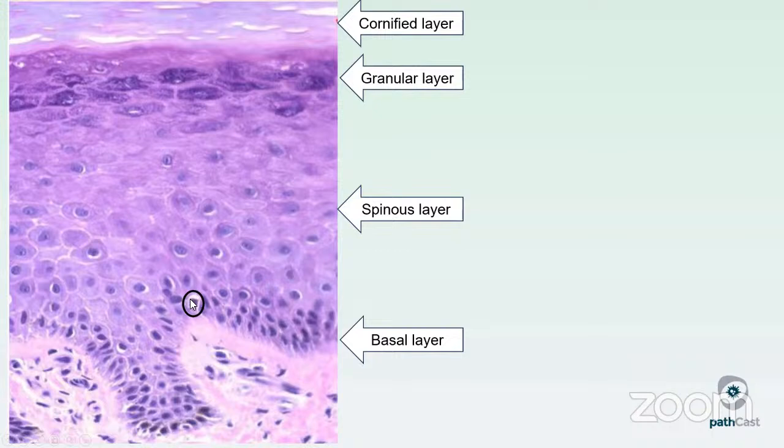And the way to know if it's a melanocyte versus an artifactual vacuole in a keratinocyte is to ask, where is the cytoplasm? The cytoplasm of a melanocyte typically shrinks and sticks to the nucleus. So you can see that here. You get a little bit of a gray-brown cytoplasm just sticking to it. And then the vacuole is around both the nucleus and that cytoplasm. That's a really nice way to tell apart those subtle melanocytes. But of course, when we really need it, we have IHC for that. So we'll often throw on some melanocytic markers, Melan-A, MART, SOX, etc., to highlight those cells.